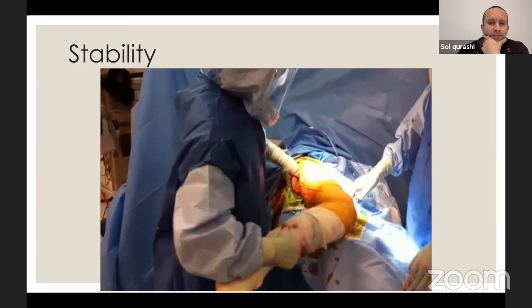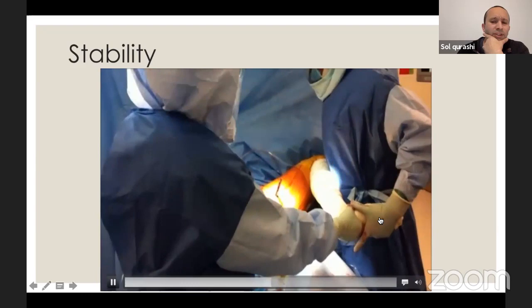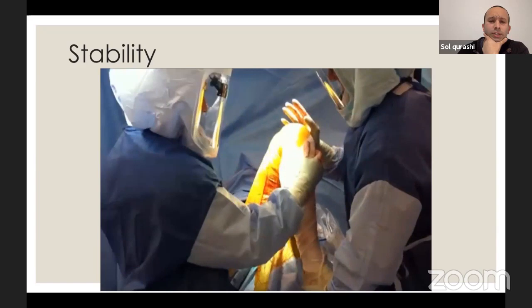You can see that the knee is touching the top of the drape over there. So he's got 130 degrees, like doing a deep squat there. I've got my finger on the femoral head. We've got a lot of internal rotation. And we call this the yoga position. So, you know, we get the foot on the other thigh as if the person is doing a chokri position. And we test everyone on the table.